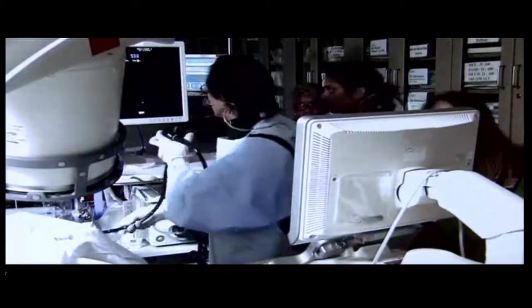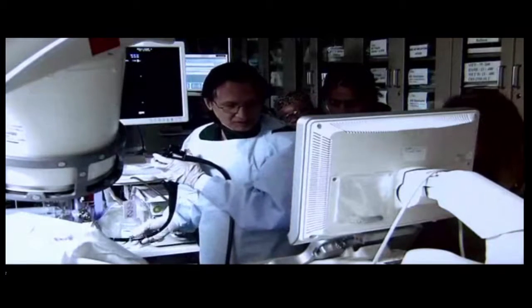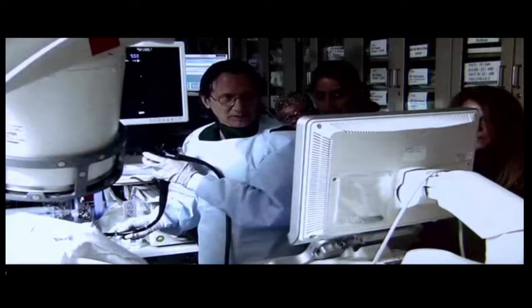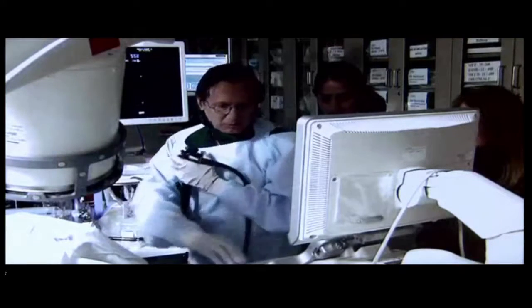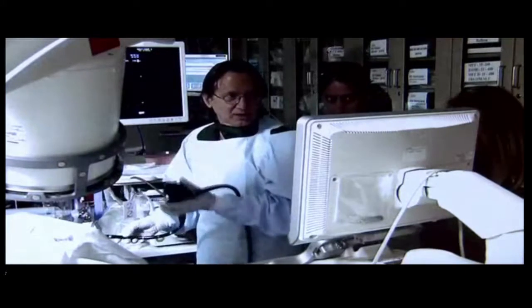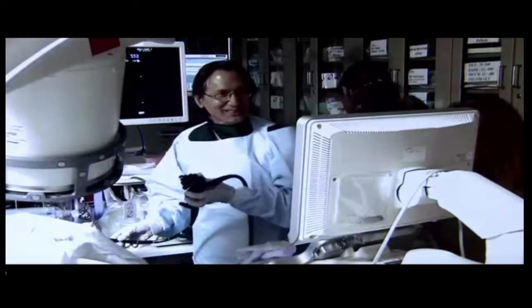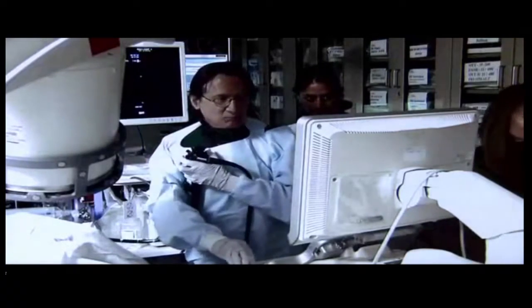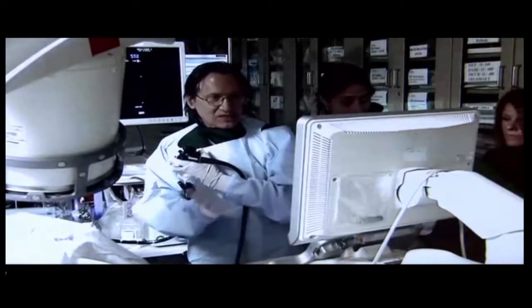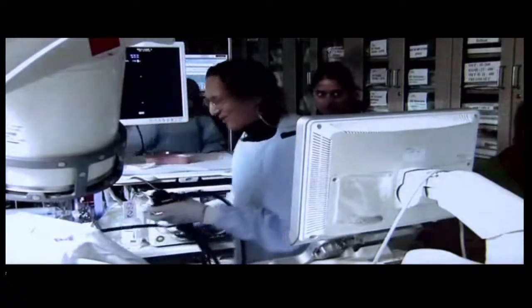Now, for some reason, we're not getting the EUS image. So just bear with us for a moment. I got it completely deflated. There's something wrong with the scope. It's really dark. So let's switch out for a different scope. Now there's something wrong with this scope. It's very dark, and we've adjusted the brightness and everything, and that's not changing it. So we'll just pull this out so we can discuss some more.